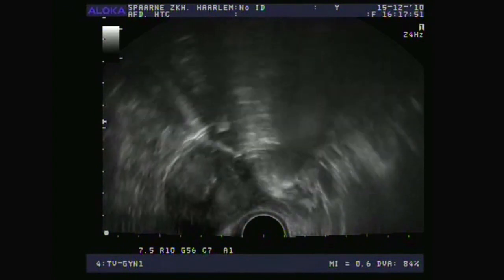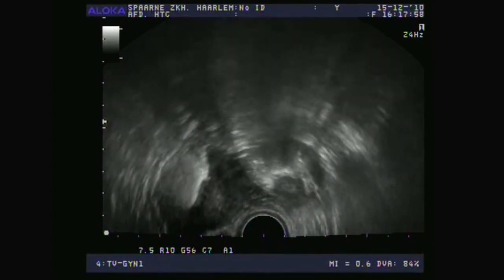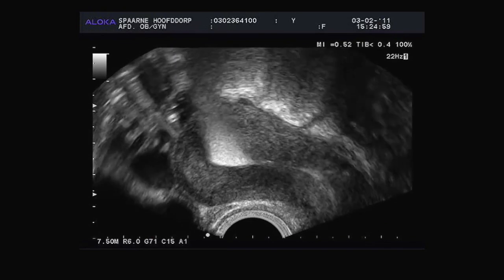But you can see clearly that the foam is appearing next to the ovary. And look — here you can see that nice, long, white line, the fallopian tube. I keep turning the tip to follow the foam. Here you can see the winding. It's so beautiful.